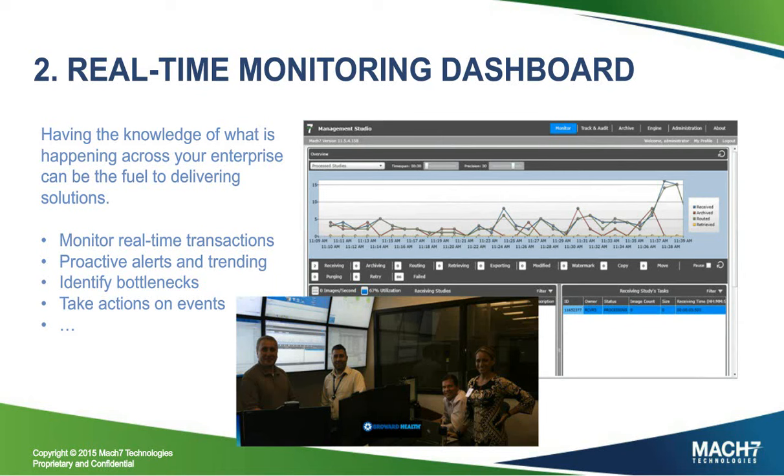Absolutely. This is Ronaldo. We've built an infrastructure based on a medical-grade network, and a medical-grade network, simply put, is a highly available, redundant network. So we have network switches and routers and servers, workstations, the whole environment monitored on a 24/7 basis, with the proper tools and staff. The picture you see on the slide is my staff with Boris on the left, and they work in this environment close to our data center on a 24/7 basis.